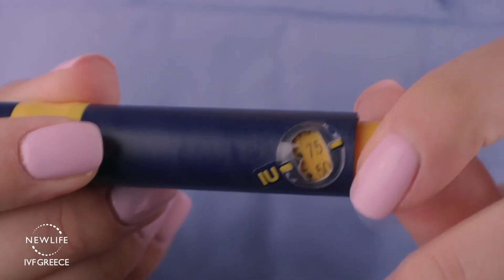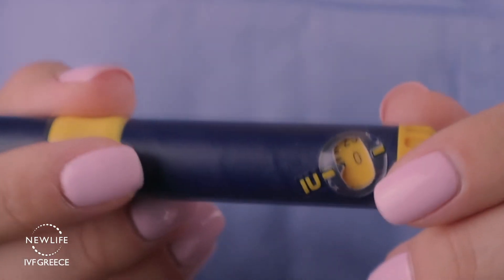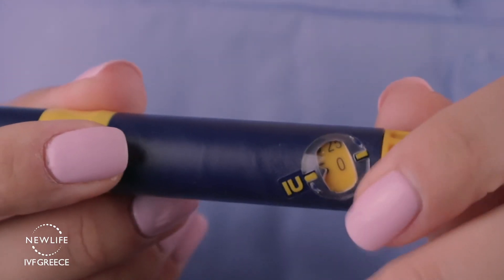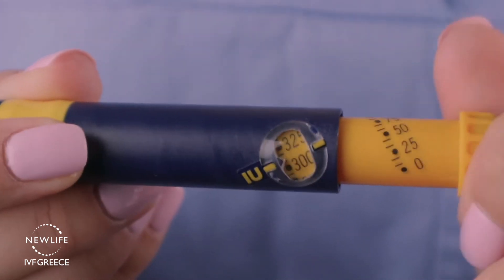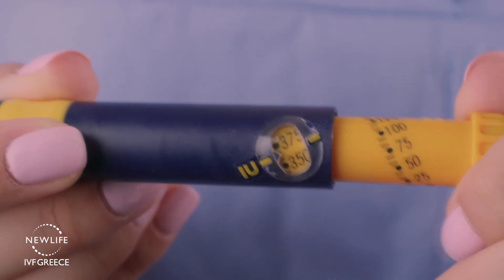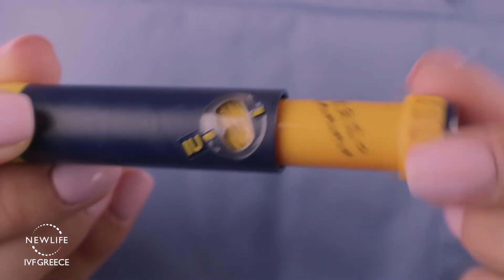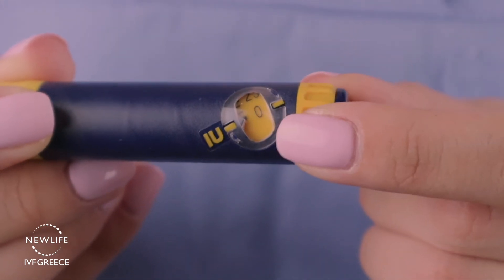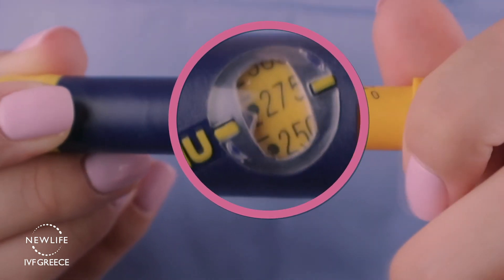For example, if the dose is 300, you will notice the number 0 appears in the dosage window. Turn the dosage knob until the dot next to the required dosage is located between the two marks on the dosage scale. If you dial too far by mistake, continue turning the dosage knob as far as it will turn and then redial back to 0. Then turn the dosage setting knob again carefully until you reach the desired dose of 300.